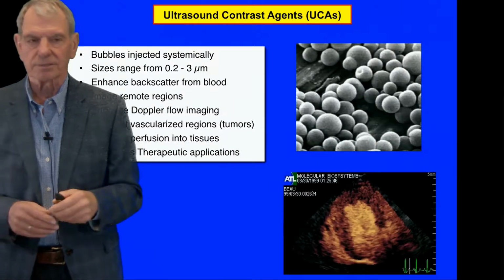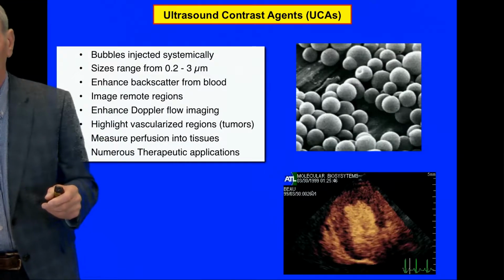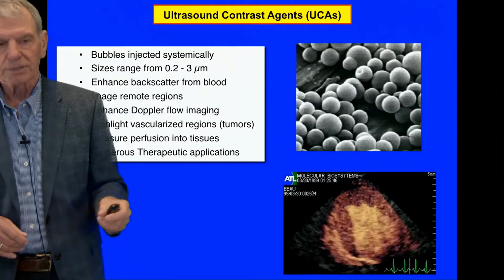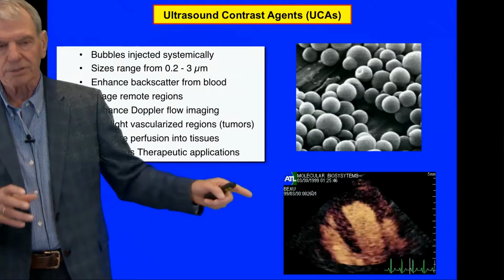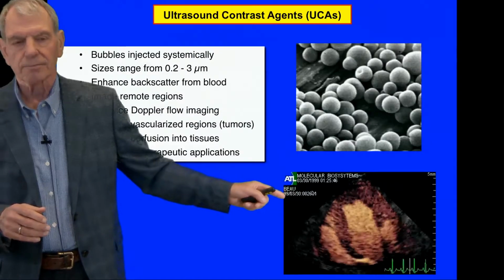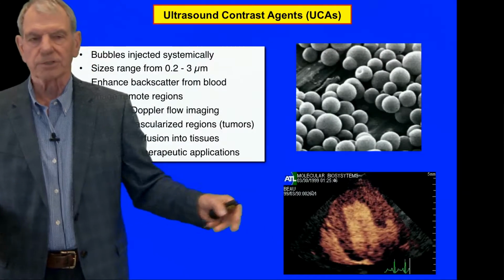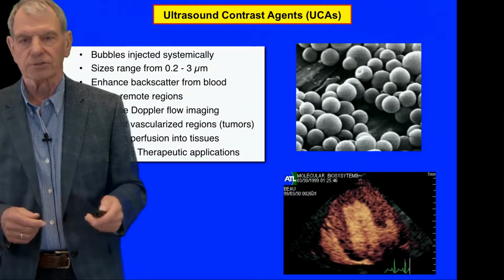Now, how else can cavitation have an effect on tissues? Well, most of you know that there are ultrasound contrast agents. They are stabilized microbubbles, and when you put the stabilized microbubbles into tissue, then they give you contrast, and if you increase the pressure, sharp pulse, you can destroy these contrast agents, and then you can see their regrowth as they perfuse into tissue, and then you can use this in cardiology to detect areas of infarctions and so forth.